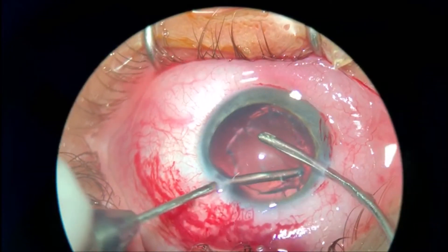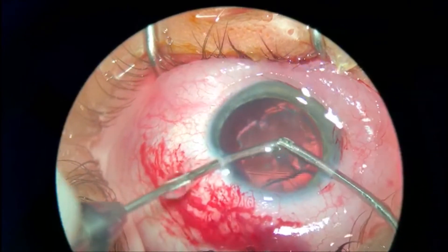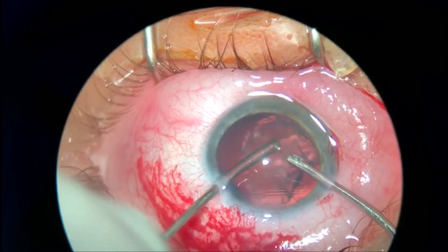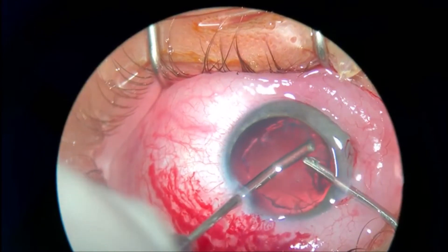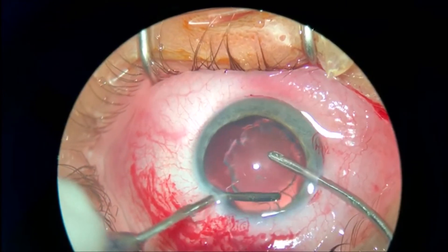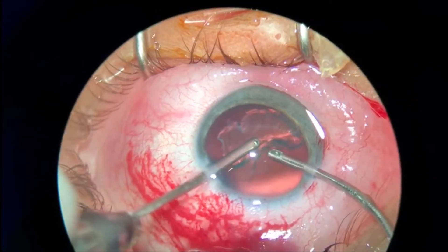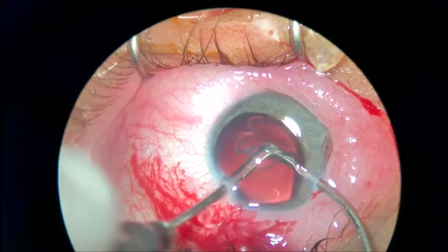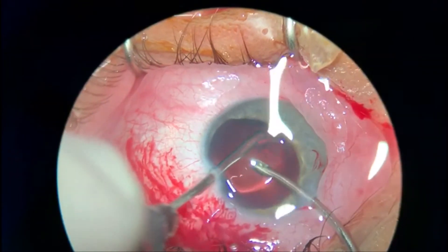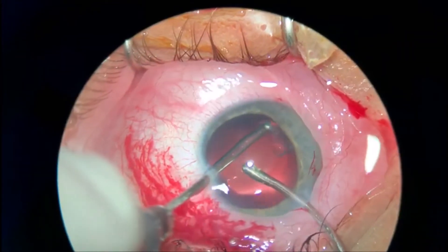The aspiration port will not get clogged by the sticky material, and slowly but surely the nucleus and epinucleus is coming out. You can also use the irrigation port to go underneath the last remnants, so the irrigation will act like a protector — the fluid will push the posterior capsule backwards so you cannot accidentally aspirate it into the aspiration port.